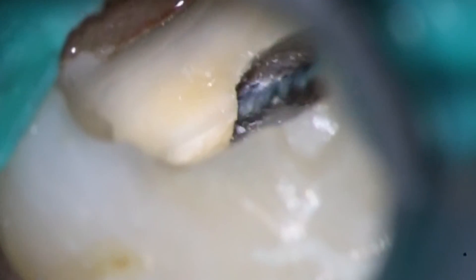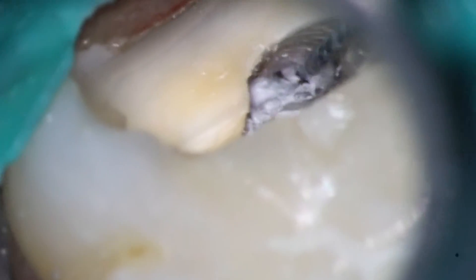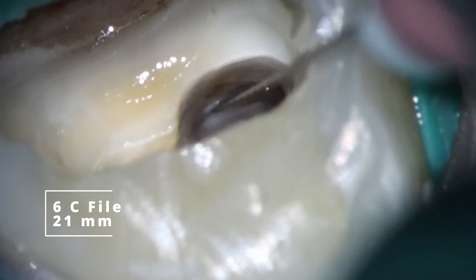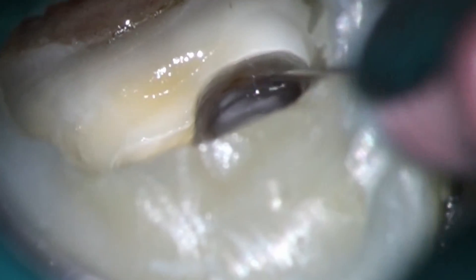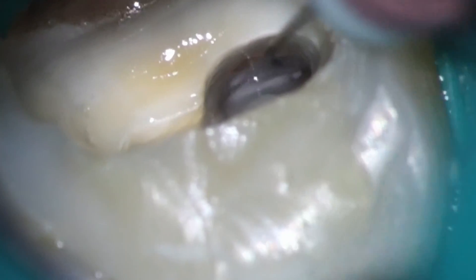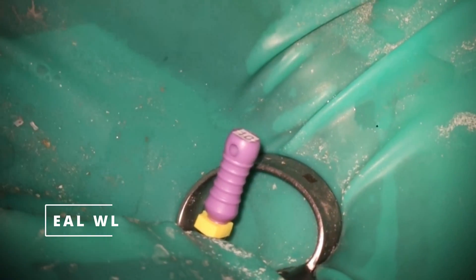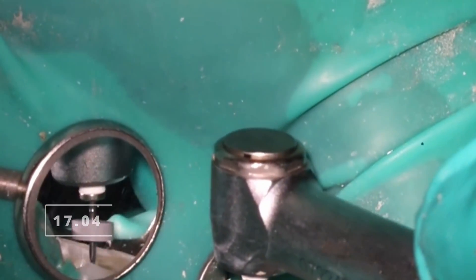If you feel like you're sticking a rotary file into metal and it's not going anywhere, that's what you want to avoid — that's when you have to trough more. You can see already I'm starting to drop down really, really nicely. And the MB2 has joined with the MB1. Looking at the cone beam again in retrospect, yeah, it probably joined in the first place. But I cannot tell you how many times I've retreated cases like this where the MB2 joined and they didn't clean it out and it still failed. You go and clean it out — it's a total Vertucci type two — and it still joins up and causes issues. So it is important to go after these things.